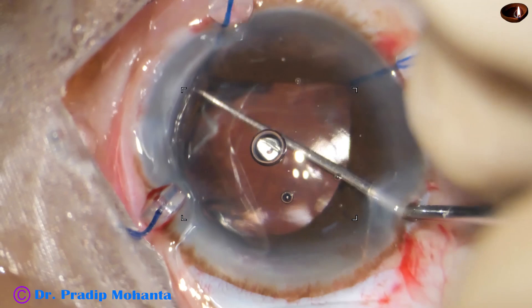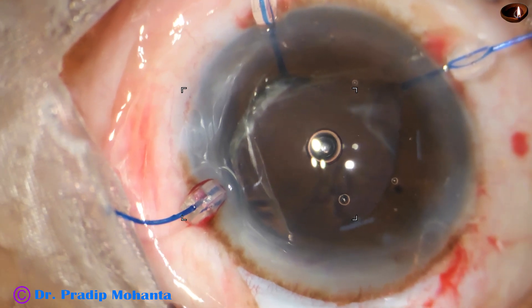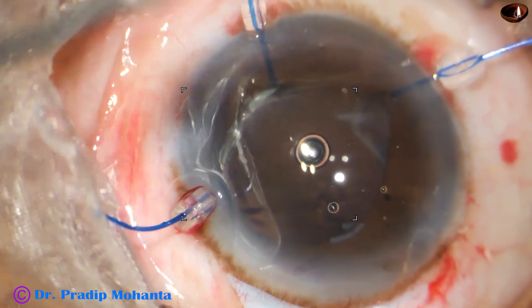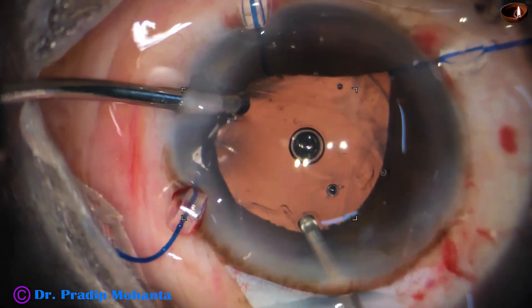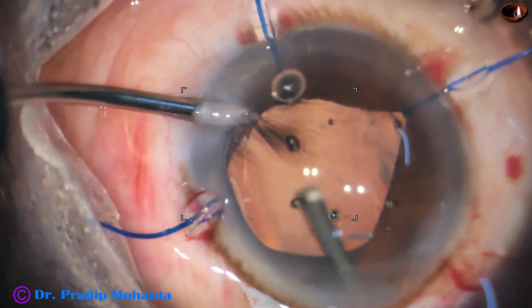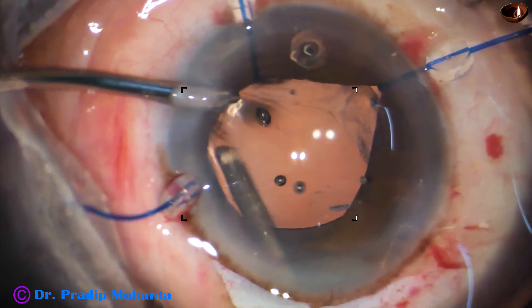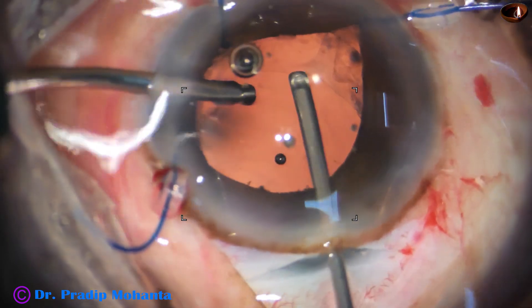I place the haptic and the lens remains central. The beauty of this lens is it doesn't rotate — it is very thin with very thin haptics. PMMA lens may rotate, but this acrylic lens with this kind of haptic doesn't rotate. The Sensar multi-piece lens is not available nowadays. This is an AuroLabs product — an AuroLabs multi-piece intraocular lens, a beautiful lens. This lens should be available so that we can manage such cases nicely.